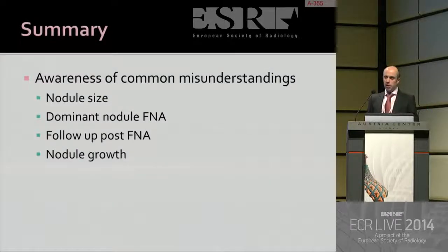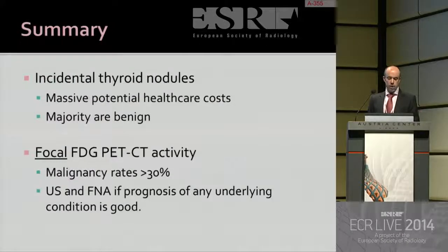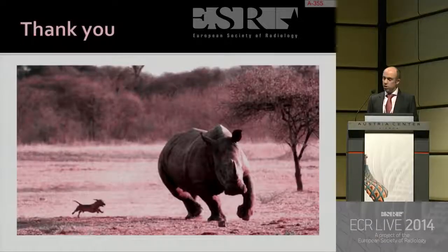These are the common misunderstandings as I see them with thyroid nodule ultrasound: nodule size as a predictor for malignancy, dominant nodule FNA, follow-up post-FNA, and nodule growth. And remember, incidental thyroid nodules are a massive potential healthcare cost to all of us, and the majority of these are benign. Yet we need to remember focal FDG activity within the thyroid gland is associated with higher rates of malignancy. So just to summarise, size is not important.